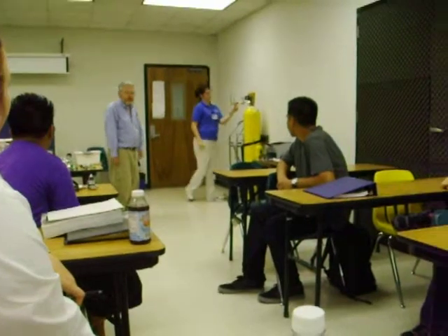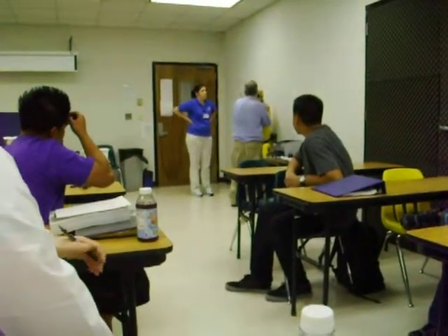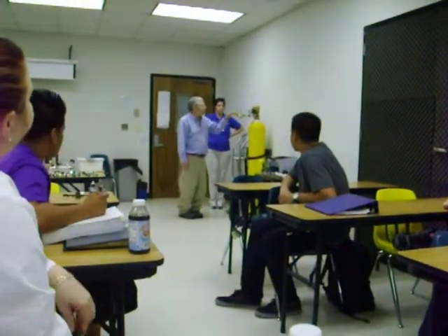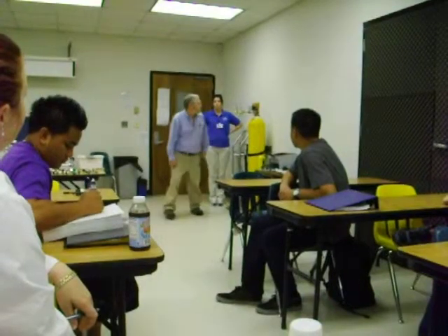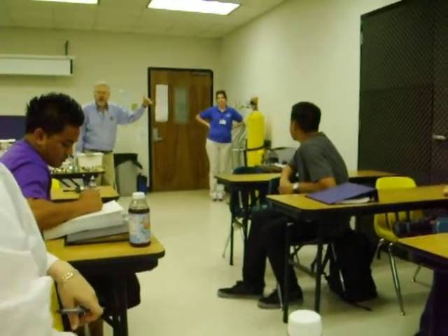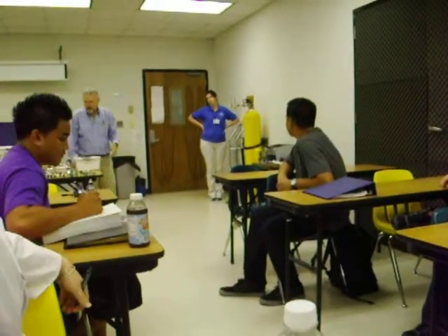Now we can use it. Now we can meter out the flow. But notice we've got all sorts of cool little gizmos. We have now flow meters that range in flow from 0 to what, 15? So we can actually meter out flow in small quantities to power a piece of respiratory therapy equipment.